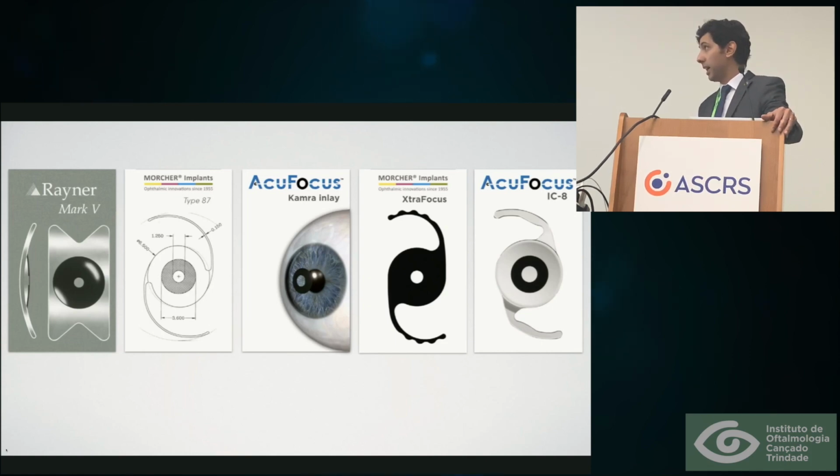And later on, we saw the development of the corneal inlay, which was developed for the treatment of presbyopia in phakic eyes initially.